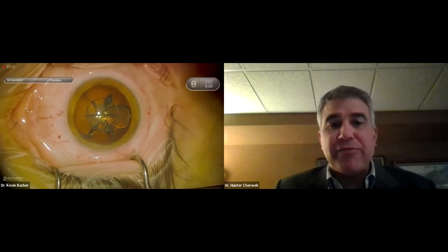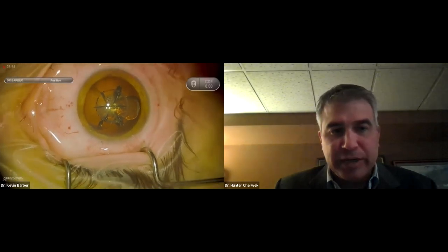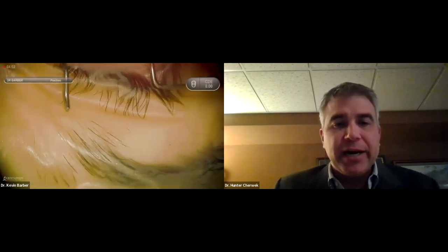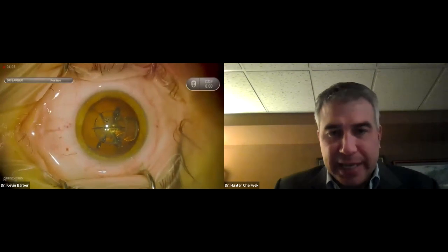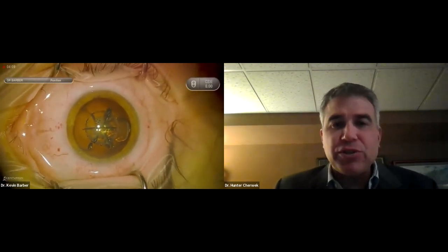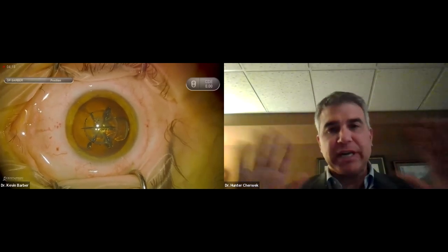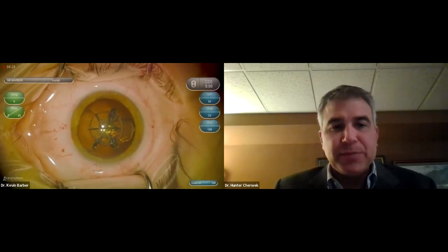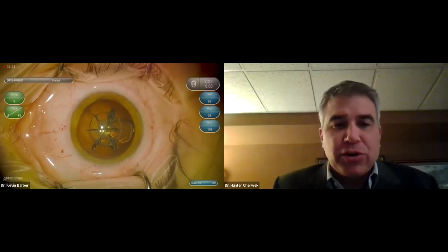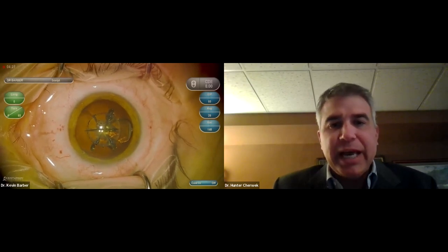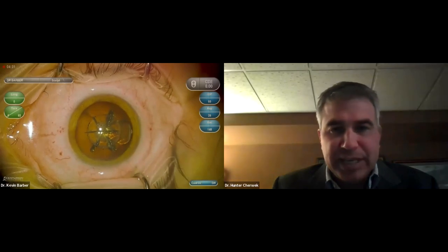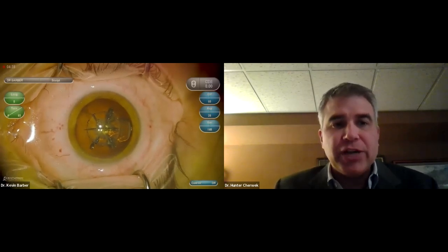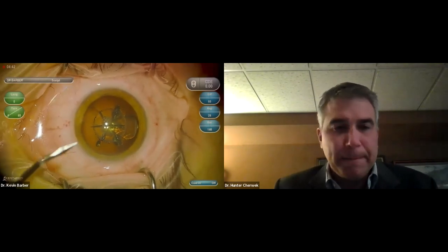This patient already has a Panoptics lens in the left eye and has fantastic uncorrected vision in that eye. Kevin is going to match and do surgery on the right eye to equalize with the left. This is a great case to begin with — the patient already had a very successful result in the left eye. The patient wants freedom from glasses; understanding their motivation and expectations allows you and your team to hit the mark.